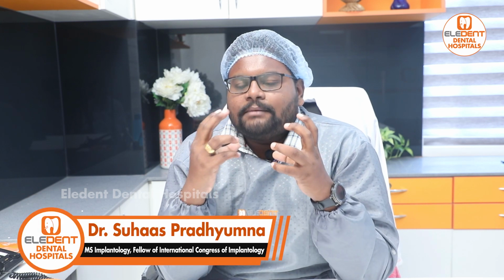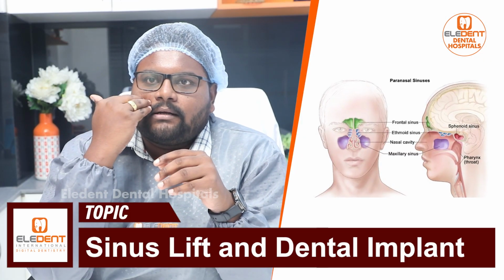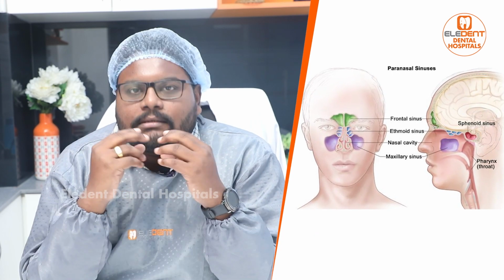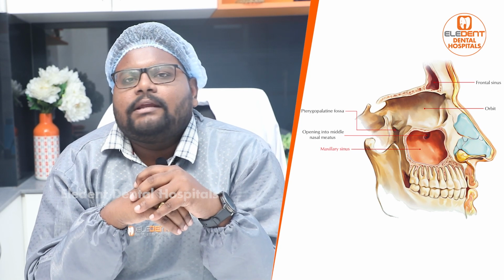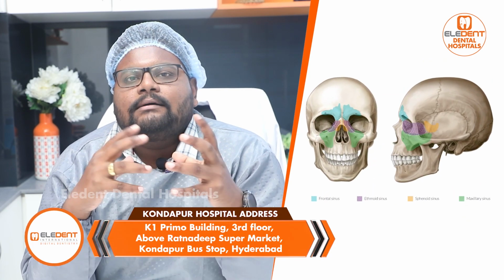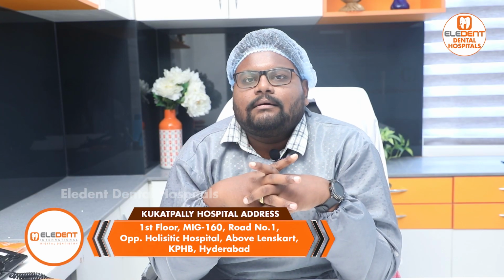When such structures are not there, there is no need for the bone to hold these structures, so the bone gradually reduces. And when the doctor sees in the CBCT that the available bone required for placement of the implant has been reduced, and the maxillary sinus, which is directly present above the maxillary jaw, droops down again due to lack of these forces, the available bone will reduce, and in those situations a sinus lift procedure is advised.